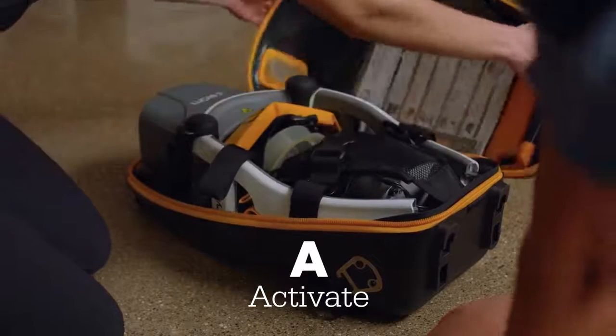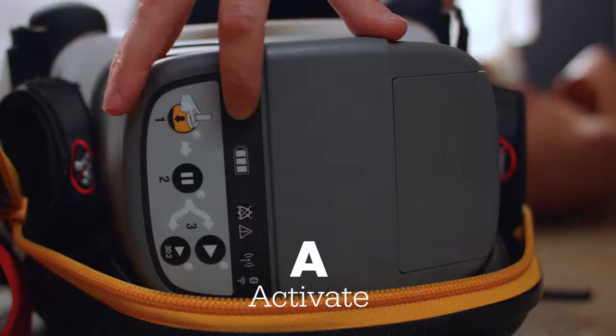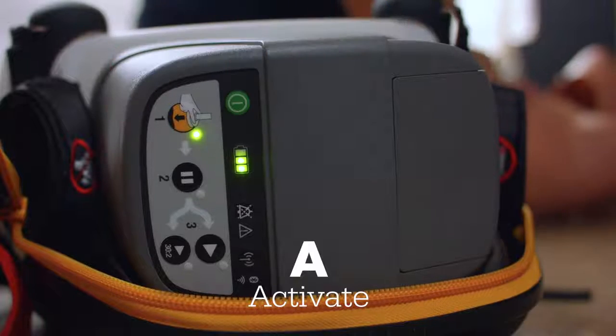A stands for activate. Open the carrying case and push the green on-off button. The device is now activated and ready for application.